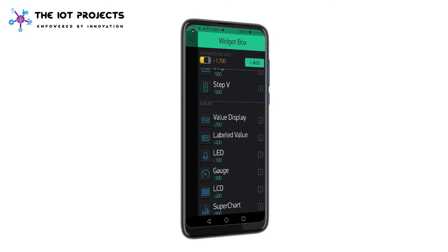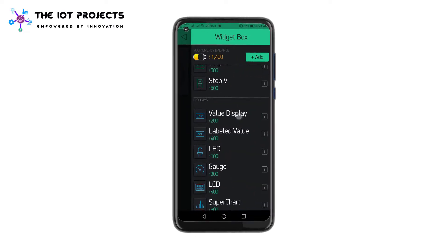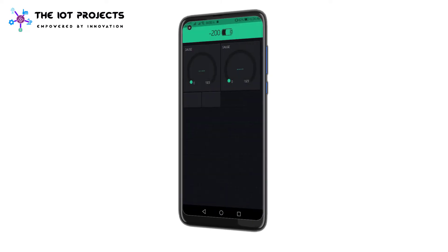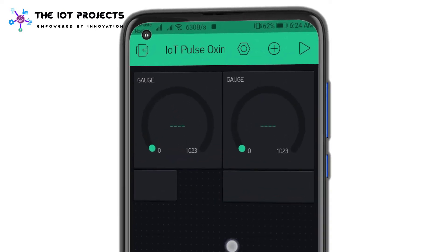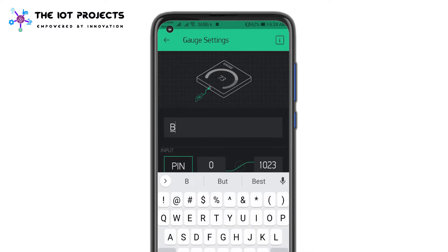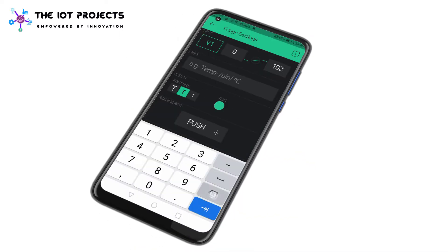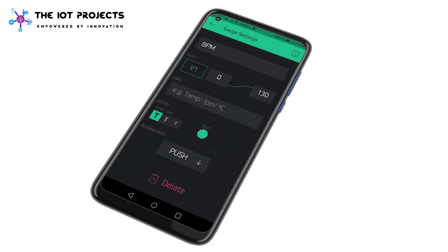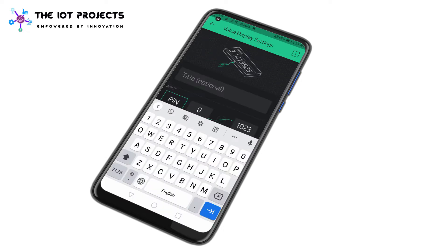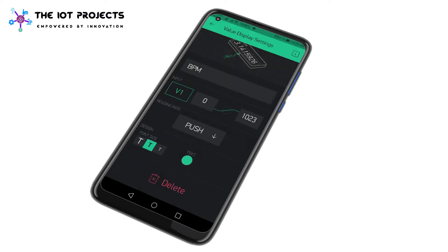Tap on the plus icon on the main screen and add two gauges, then add two value display widgets. One will show the BPM values and the other will show the oxygen level as SPO2. For BPM, select virtual pin V1 and set the value range from 0 to 130. You can also set the colors for this gauge. Then set the same values in the value display widget.